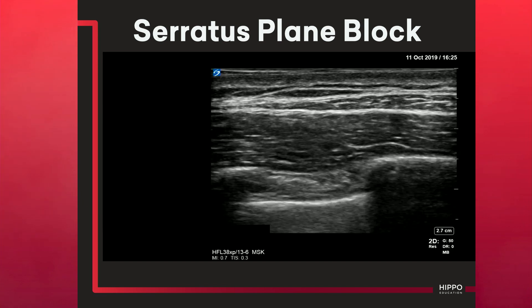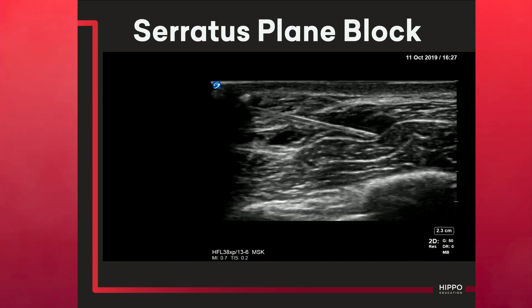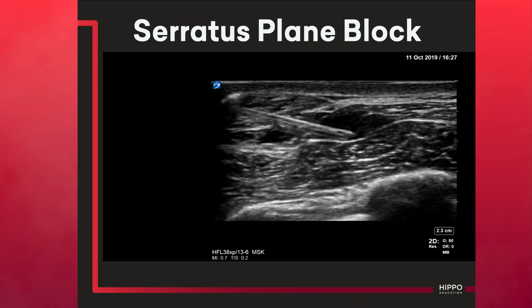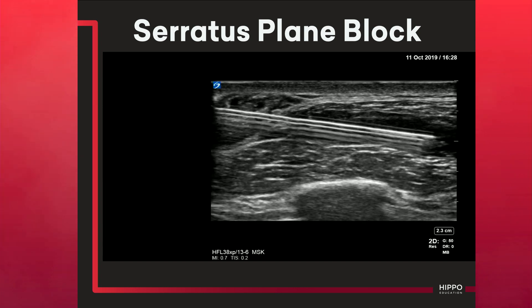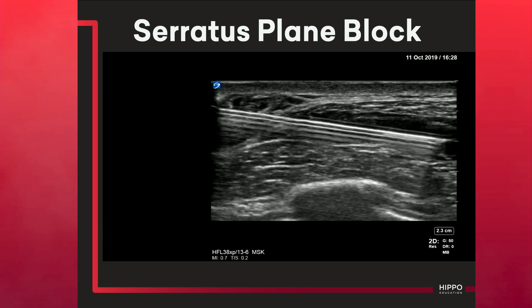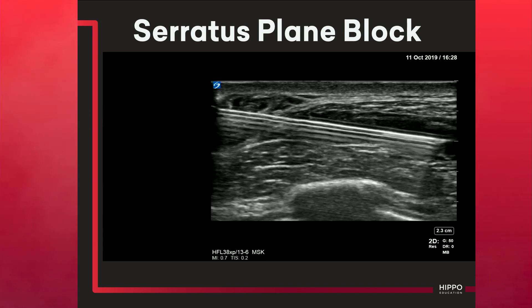The in-plane technique is wonderful for serratus plane blocks or other fascial plane blocks — we like this for large volume blocks. You can see us dissecting the lat from the serratus, and after you've made that little anesthetic wheal, you can start to hydro-dissect further to peel away that muscle from the fascial plane.